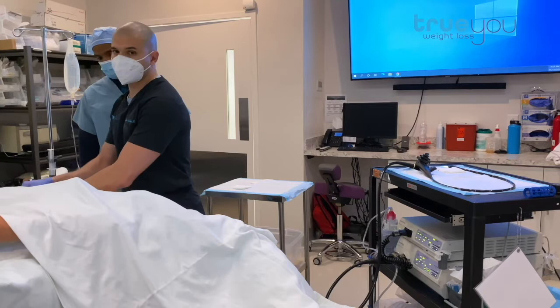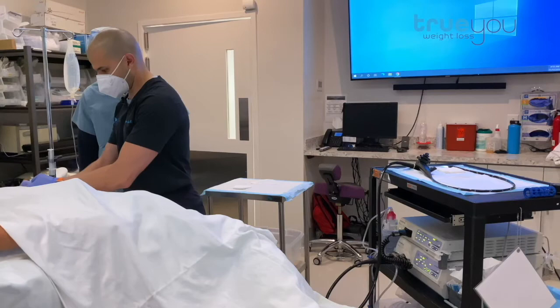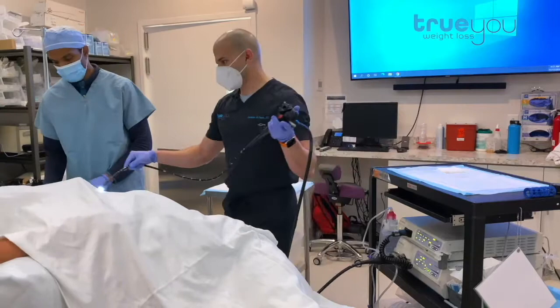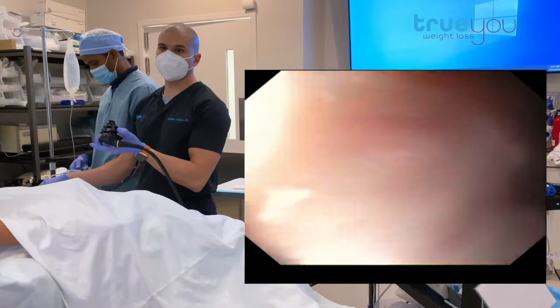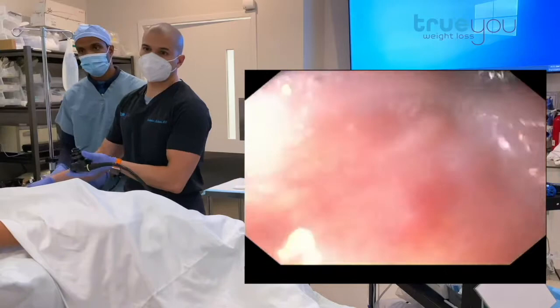We're going to follow it with the scope and then we'll fill it. So that's in the stomach. We now take our scope again and go right down next to it. Now we'll fill it in just a moment — there's our balloon. We're going to put it down a little further; it was just peeking up into the esophagus. We want to make sure it's all the way in the stomach, and now it is.